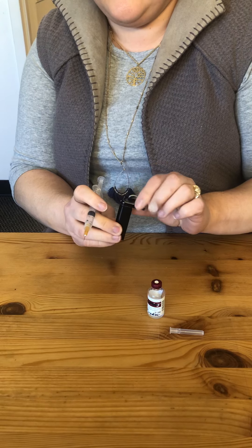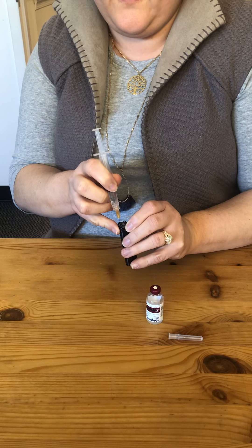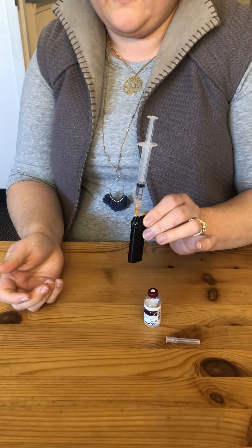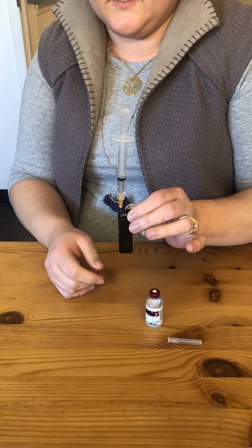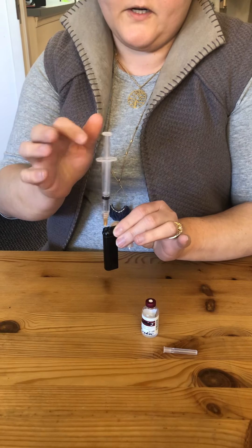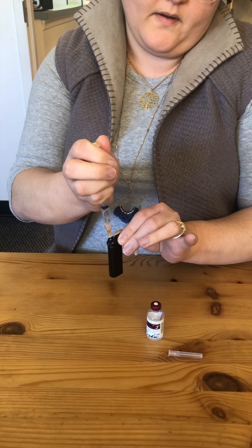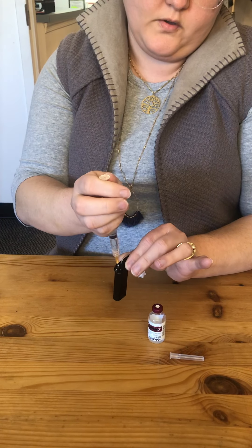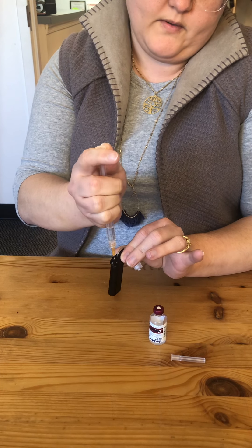The next thing I'm going to do is put that needle through that self-healing membrane on the top. It's only going to go probably about a third of the way through — that's okay, as long as it's in enough to hold the syringe up it's in plenty far. And then what I'm going to do — and this is the important part — is pull up on this plunger. So you can see I'm not pressing the insulin in, I'm actually pulling.